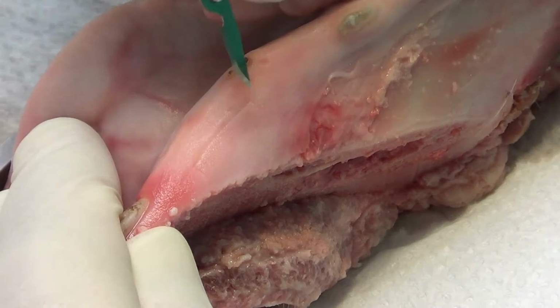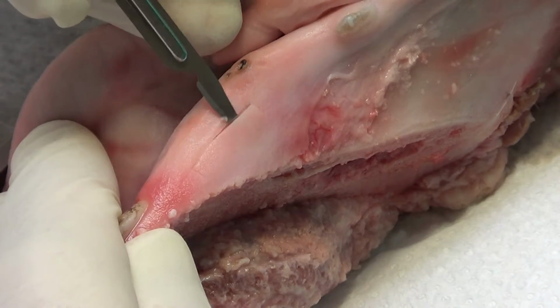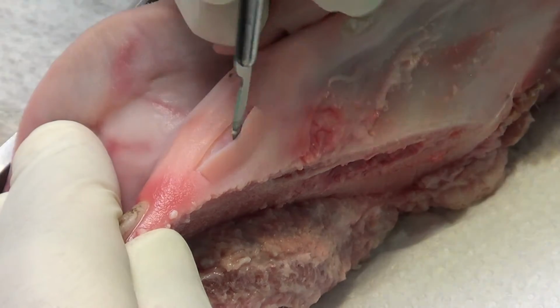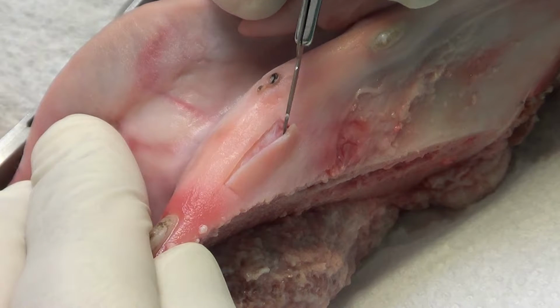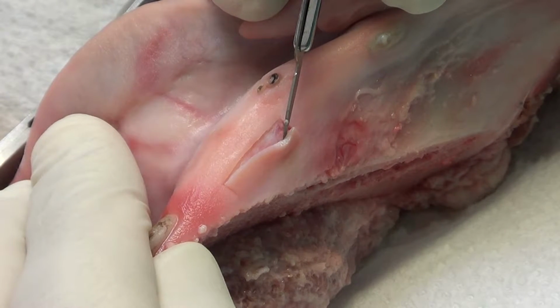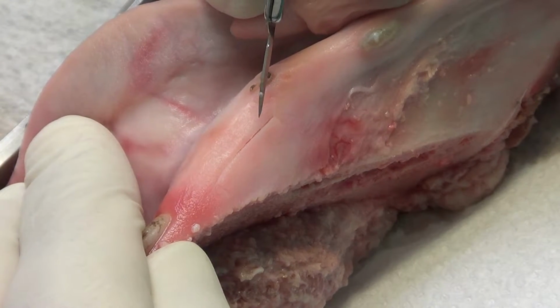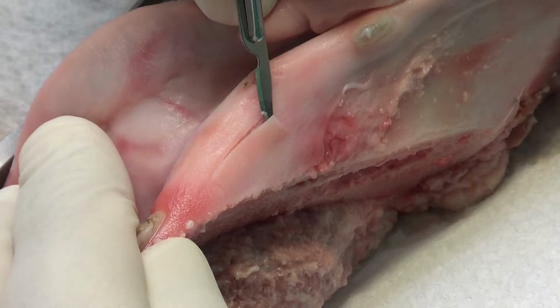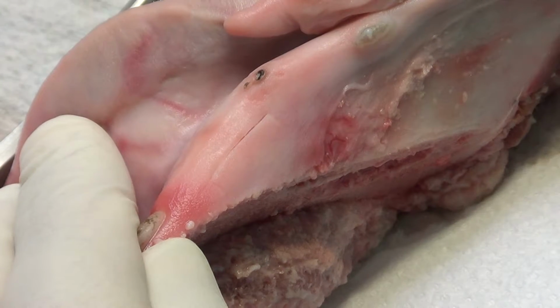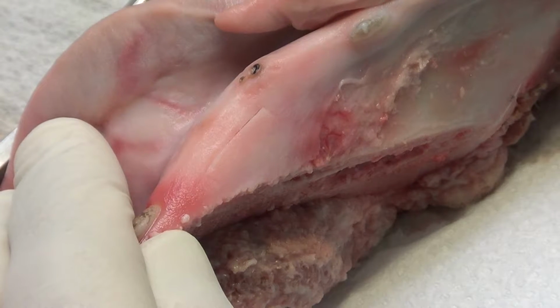Okay, so don't be afraid to go deep and maintain exactly the same direction to obtain a correct quantity of the tissue. Not 2 mm at the beginning and 3 mm of thickness at the end. Try to be really precise. Do this step and then we will remove.